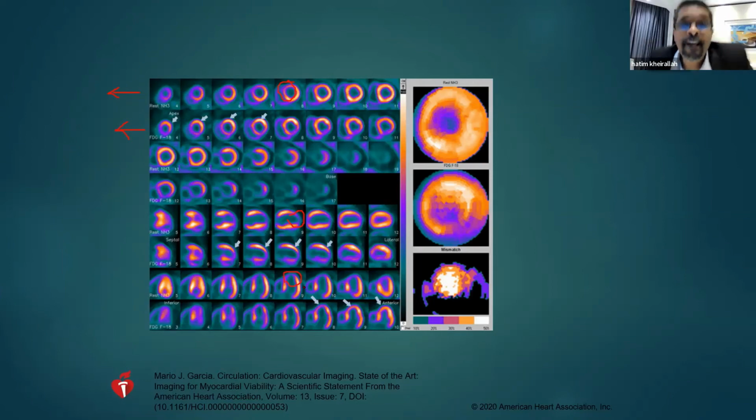Echo, you know, I don't care about metabolism, not metabolism, cell membrane. The contractility can be detected. I'm gonna induce contraction. If I induce contraction, it's like you have someone and you want to wake him up. If he wakes up, starts to shiver and comes back, it's a clear sign that he is not dead. Now I'm gonna elicit contraction, which is so gross, you know.